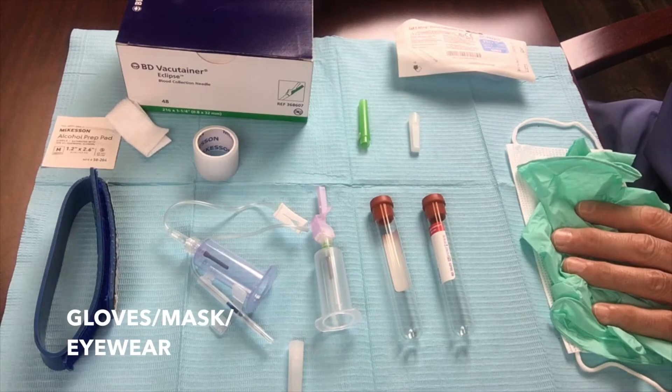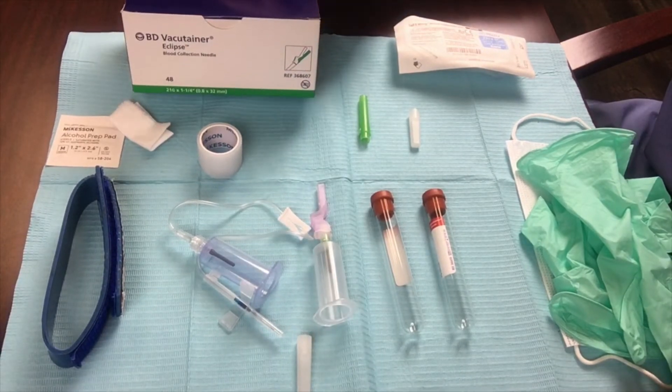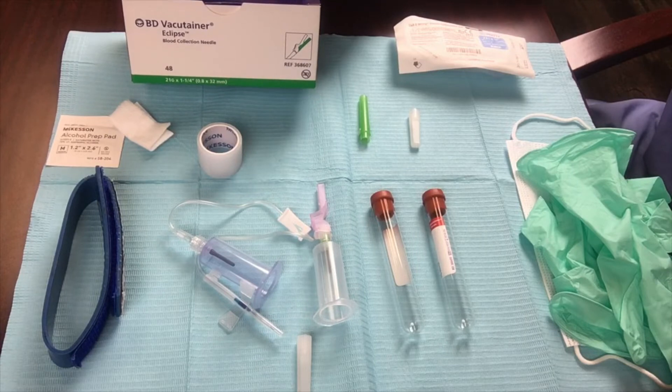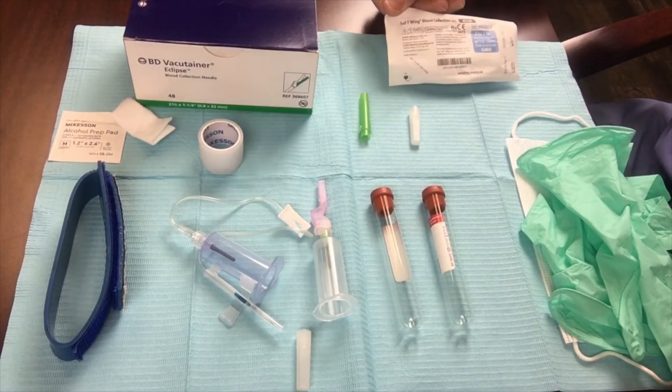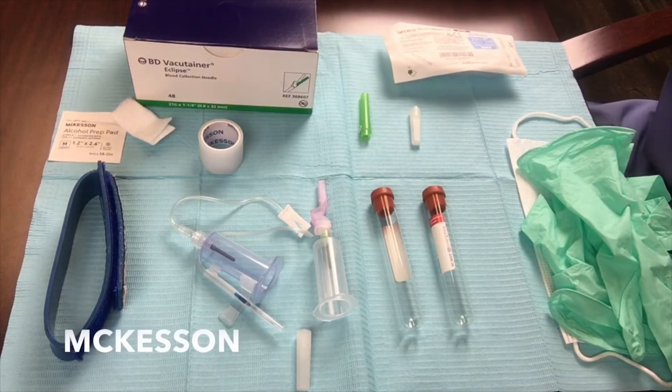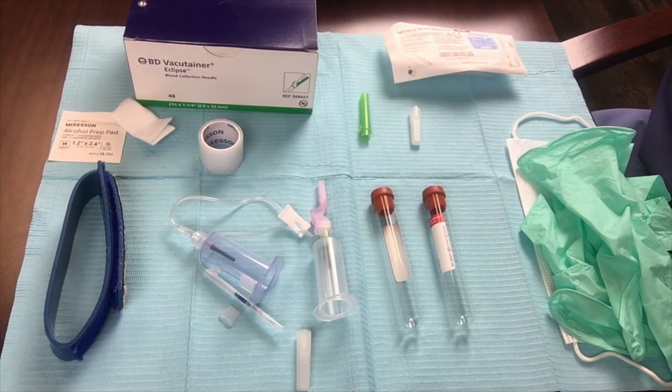Of course, you need your personal protective gear — gloves, mask, and eye shield to protect you against bloodborne pathogens. This is a vacutainer eclipse box with the needles. This is a safety wing blood collection set. I ordered this stuff from McKesson. When you pull this together, minus the tourniquet, you're looking at a dollar or two per patient — very low cost from this standpoint to get set up to do phlebotomy or to draw blood on your patients.